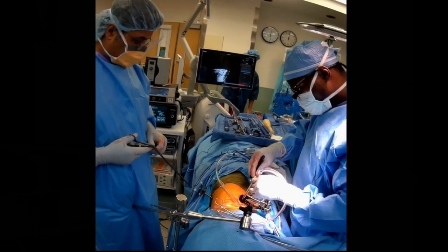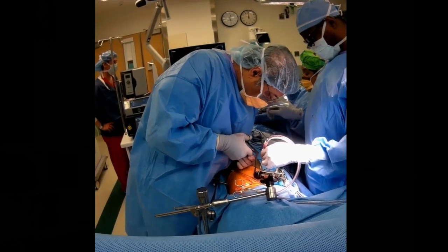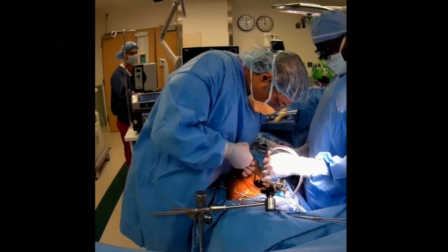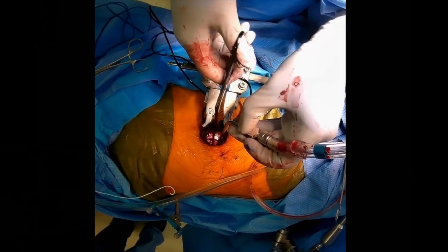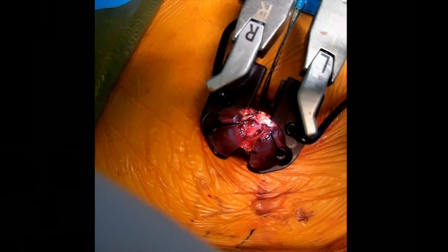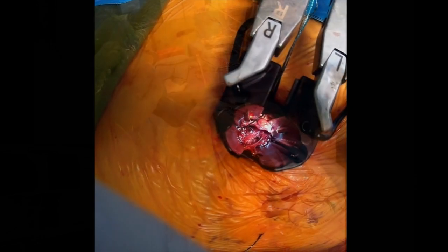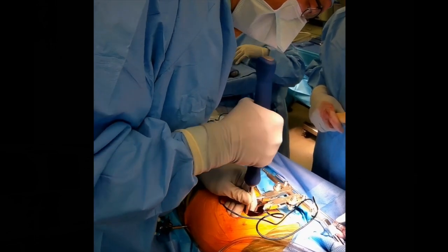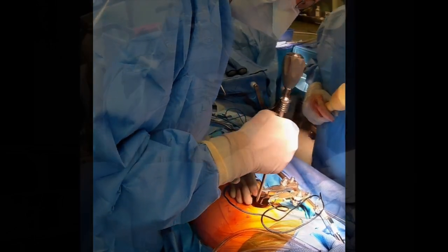This is the visualization that is achieved after the retractor has been placed and the light sources are also placed. After that has been performed, the disc is incised and using rongeurs disc material is subsequently removed. This can be done with rongeurs and a combination of curettes to loosen the disc and to remove as much disc as possible.